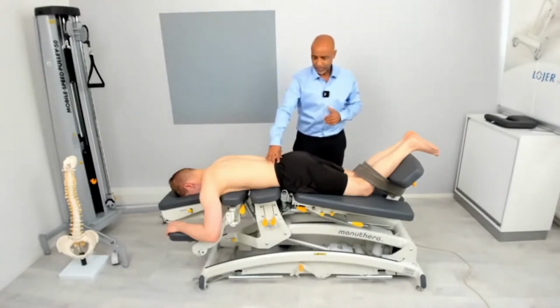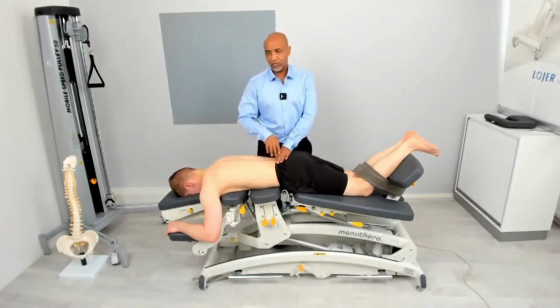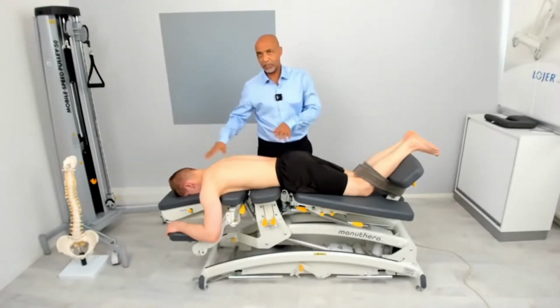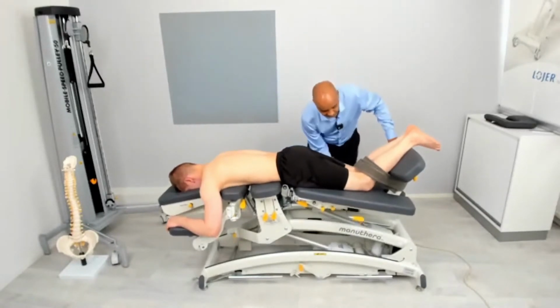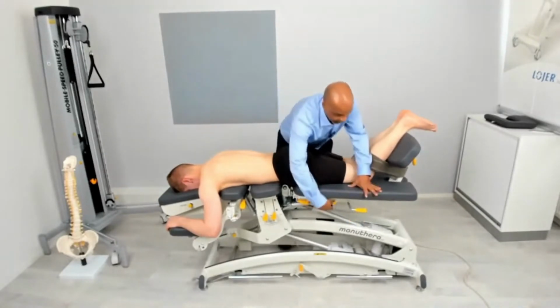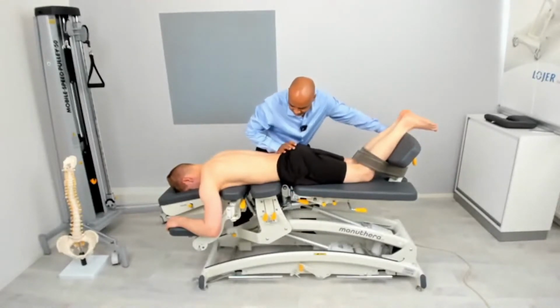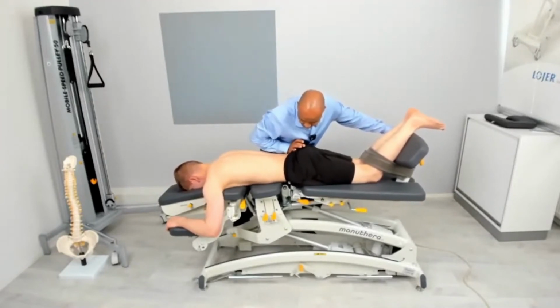Traction. So there are some patients, for example, the older patient, who don't like to be put upside down because of the blood pressure, or any other reason, they cannot be in that particular position. So what you can do in this particular case, you can make sure that it's level, and then you go into traction. So you can assist doing traction by this particular movement. This will help to decompress the spine.